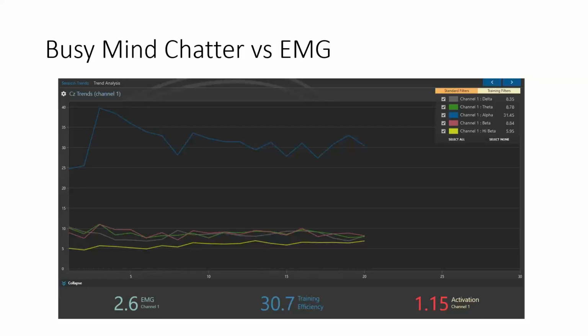These muscle tensions in beta distort sLORETA. And that's why I say, yes, sLORETA is 100% accurate, but it's certainly not going to be in the beta ranges, especially anything over 20 hertz. You can see it's so easy for muscle artifact to disrupt sLORETA, and even the scalp shape is critical.